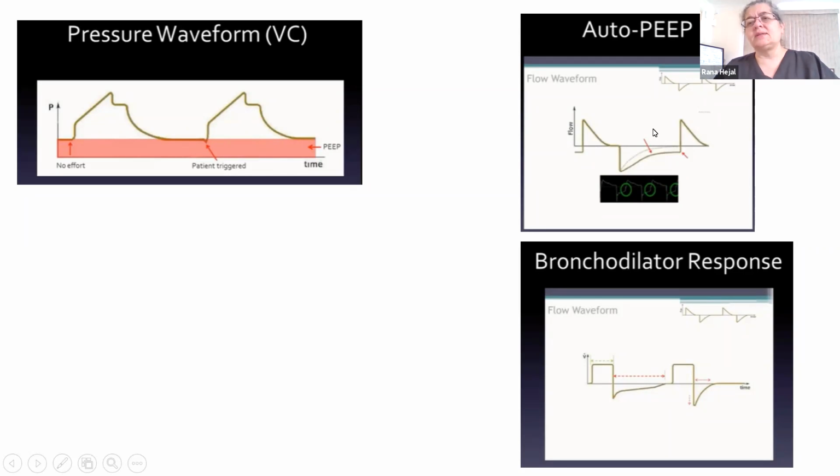If you add this to the tidal volume that you're getting, to the actual tidal volume that you're getting, you will see that on a breath by breath basis, the tidal volume increases. And often this gets missed, and they are calling you to take care of somebody's blood pressure because the patient's heart rate goes up, or they went into atrial fibrillation and their blood pressure is dropping.